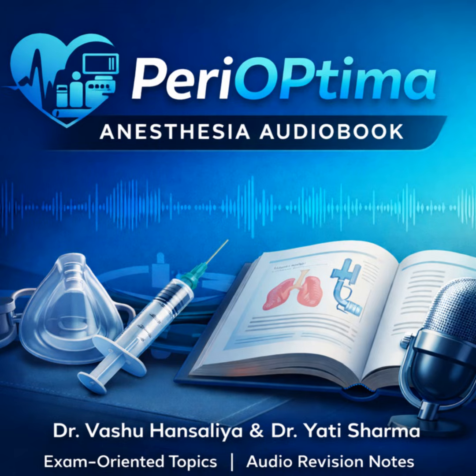A perfect summary. These systems are the boundaries that contain the phenomenal power and the potential risk of the anesthesia machine, and they require human knowledge to complete the loop. That brings us to our final provocative thought for you to take away. We've established that hypoxemia is the final common pathway to catastrophe, and we know that our most relied upon detector, the pulse oximeter, has a specific documented inaccuracy. In that critical 76% to 90% saturation range, it may read up to 5% higher than the measured arterial saturation. That is a very clinically relevant blind spot.